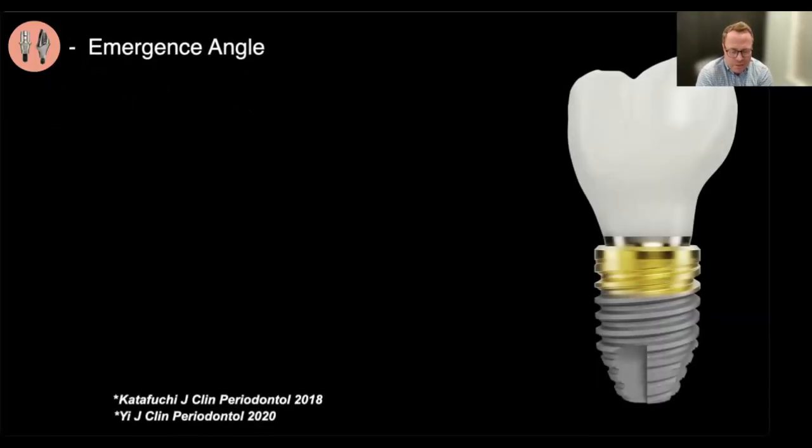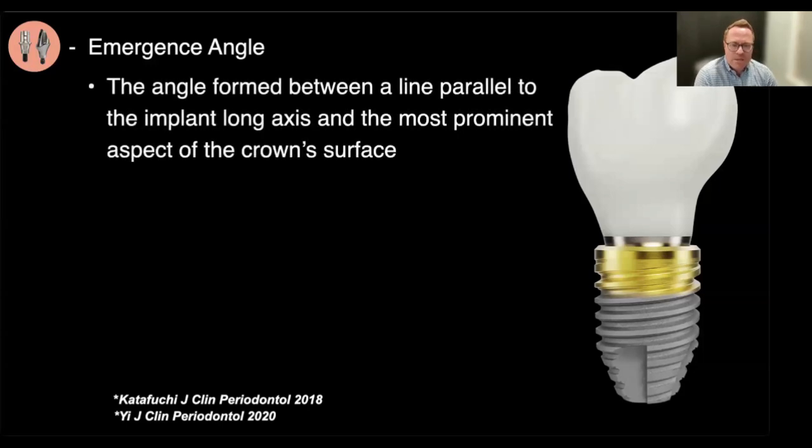And emergence angle is something that's got a lot of publicity recently, and I think it's a great topic. But what it's discussing is if we take a line kind of along the long axis of the implant, and then we measure the most prominent point of our emergence profile, and we measure this angle. This is what we call the emergence angle.